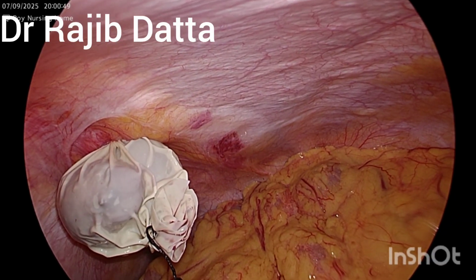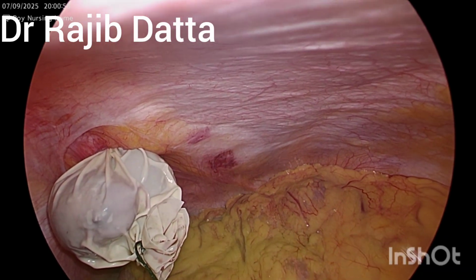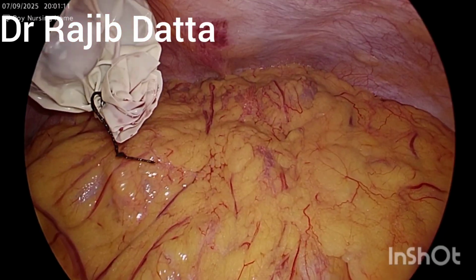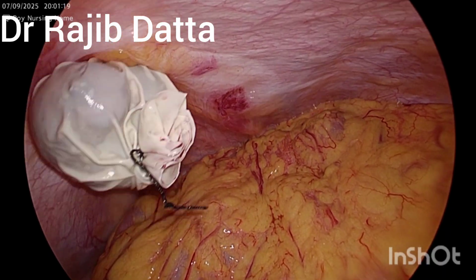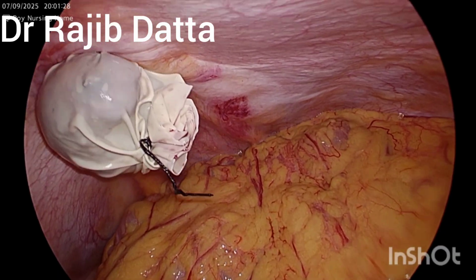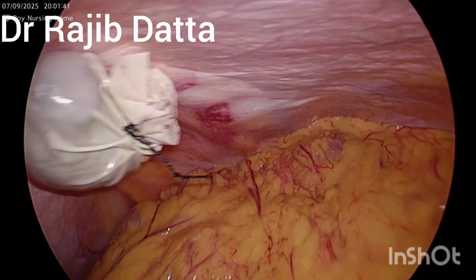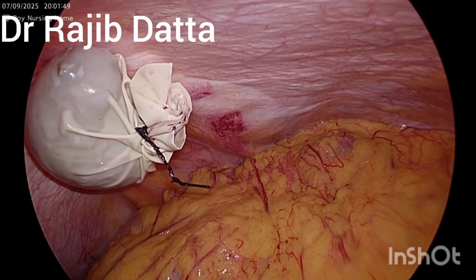So we are trying to retrieve it out with the help of the large curved hemostatic forceps that has been introduced to dilate the tract, and we are constantly taking care not to rupture the endo bag, otherwise there will be spillage of the stone and bile into the abdomen. That's why we are going to use this endo bag.